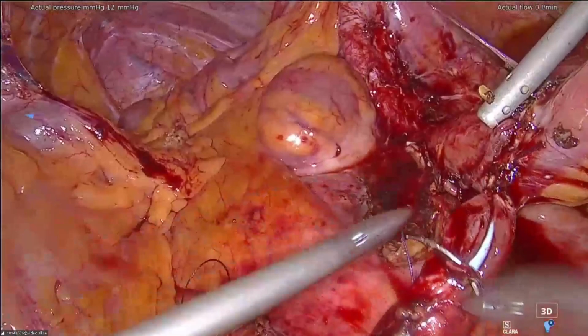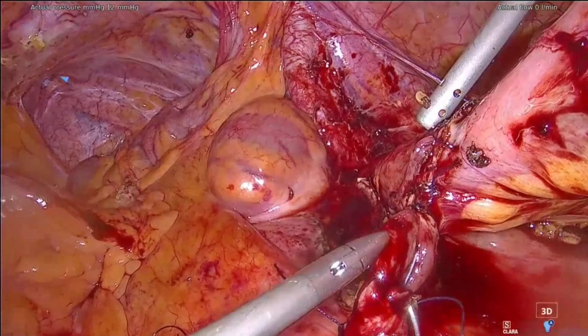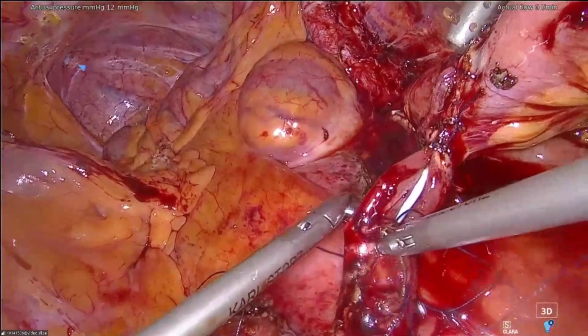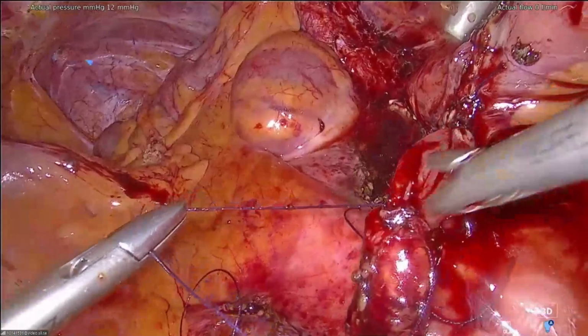How did you choose the length of the flap to be developed from the bowel to connect it with the ureter? I mean, if the length is not enough, you don't perform a tension-free anastomosis. But on the other side, you risk reducing the caliber of the bowel itself a lot.